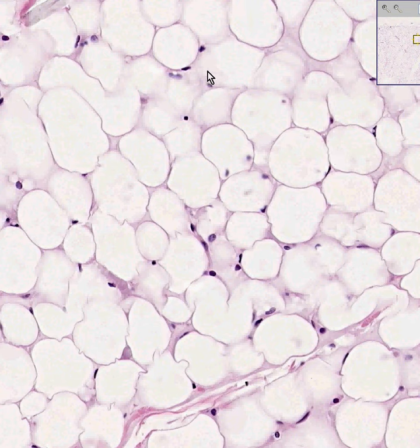So that's probably an adipocyte nucleus. That probably is. That could very well be. Perhaps that's a lymphocyte. Perhaps that's another round cell like a lymphocyte or a macrophage. You really can't tell just from an H&E stain. And don't forget, you may have some collagen fibers here and there, and you may also have blood vessels like we see here. And we could definitely see some red cells within blood vessels here.